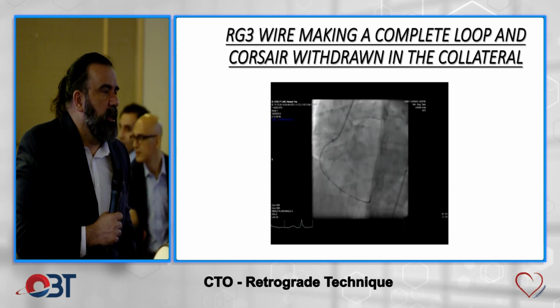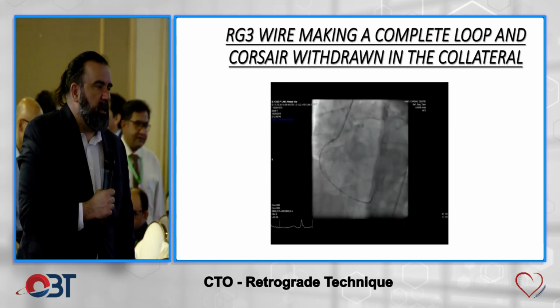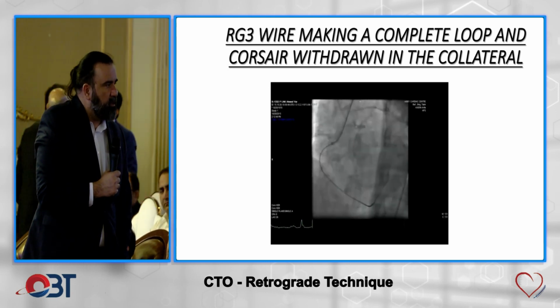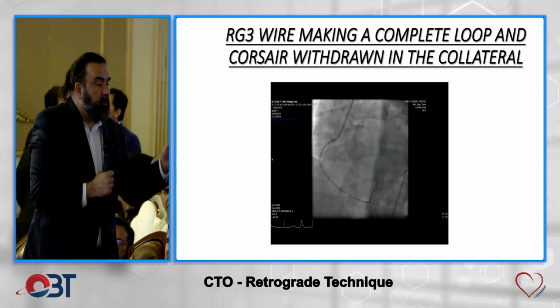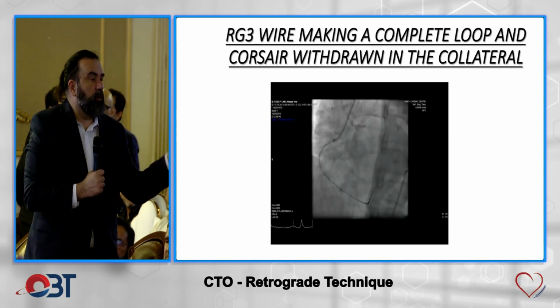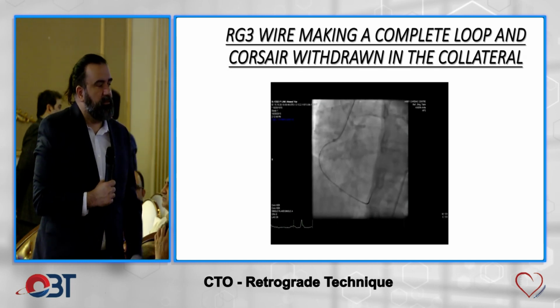So I would say कि when you start doing CTOs, case selection is important. Try doing, typically, what the experts call relatively low J-CTO scores. Once you are more comfortable, then you can make it more and more complicated. But even those simple cases, which for an expert would take, like that case I showed you in the last session, took me an hour and a half. But if I'd started off, that would take me about 6 hours.